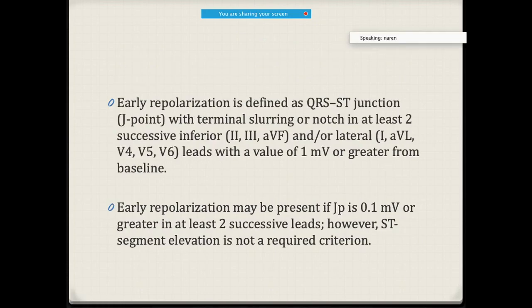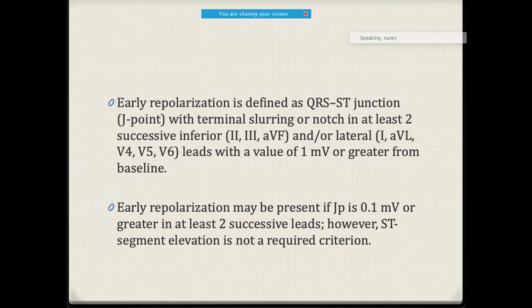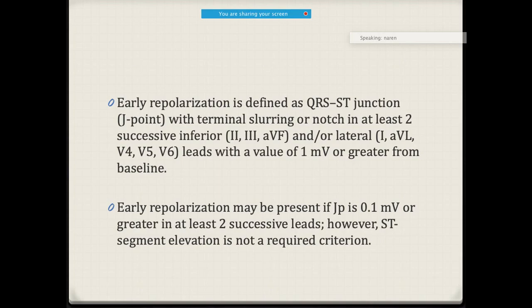The J-point is the junction of the QRS and ST segment. To call it as early repolarization, it should not be just one lead — in a segment lead, for example, in the inferior leads or lateral leads, at least it should be present in two successive leads. For example, in inferior leads like 2, 3, AVF — at least two of them should be present. Similarly for lateral leads like 1, AVL, V4, V5, V6 — at least two should be present. The repolarization value should be at least 0.1 millivolt.